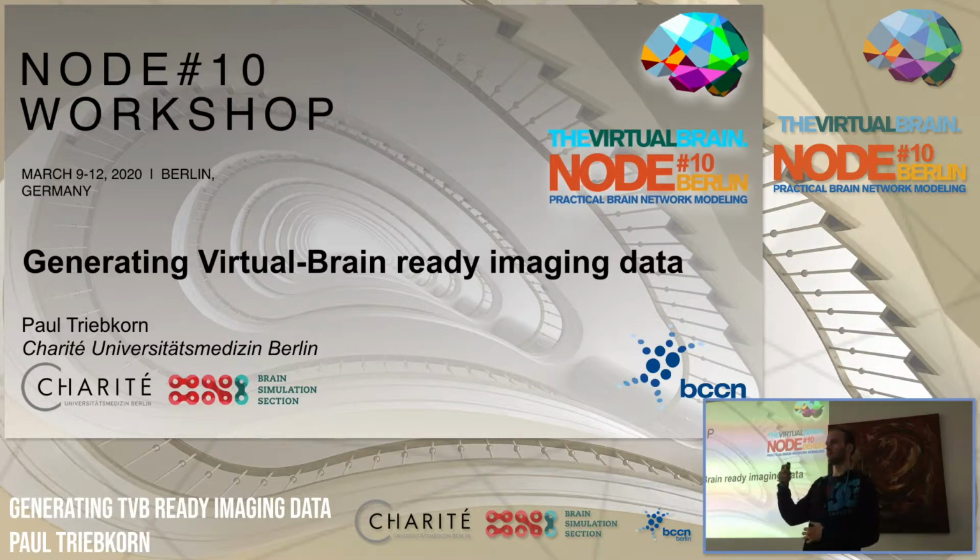Yeah? So you were using the default connectome data that was provided with TVB, or we gave you, but now we want to know, okay, what do we have to do to actually get this data before we can run a brain network simulation with the virtual brain.